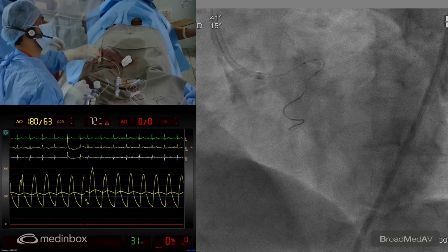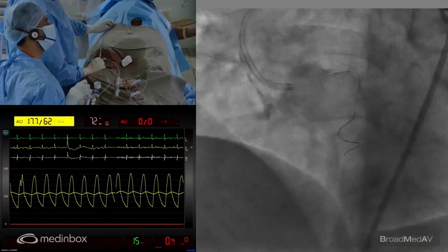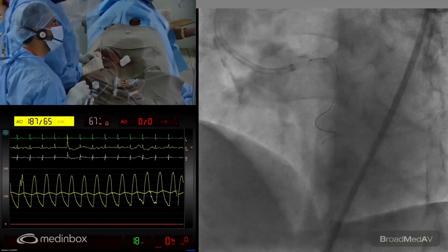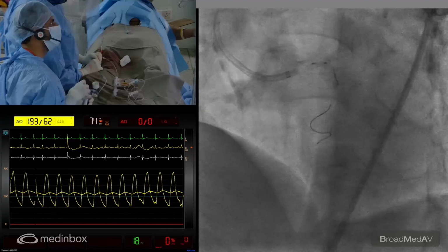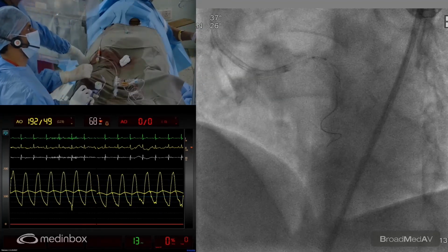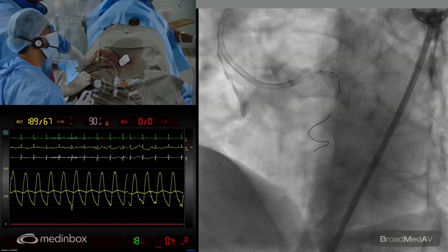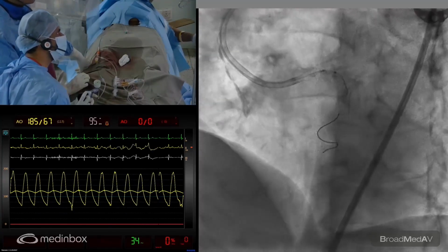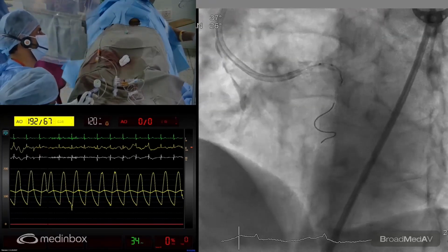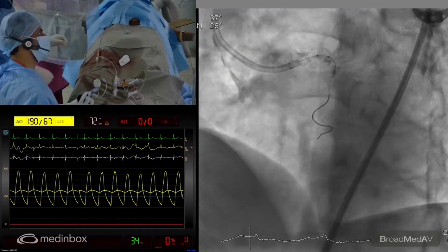Okay, I think it is very important not to disturb the ostium. So we are now distal. We're just slowly getting that down. Okay, I'm going to do a cine to see whether we are inside the stent. Difficult to make out, but come to the caudal.